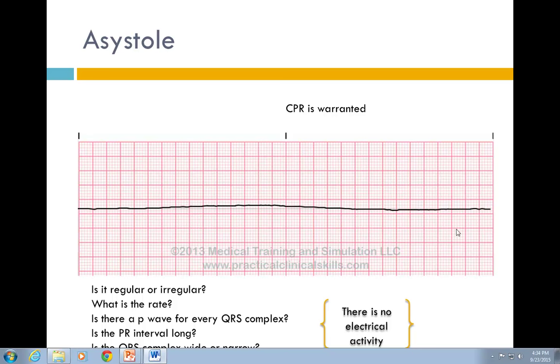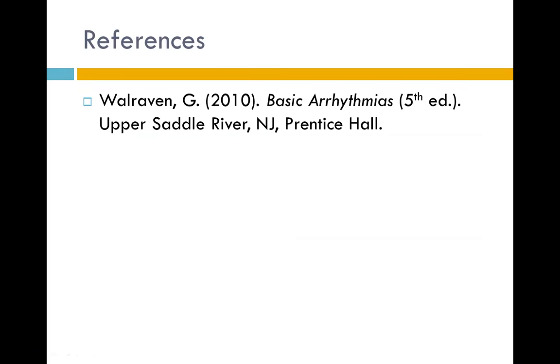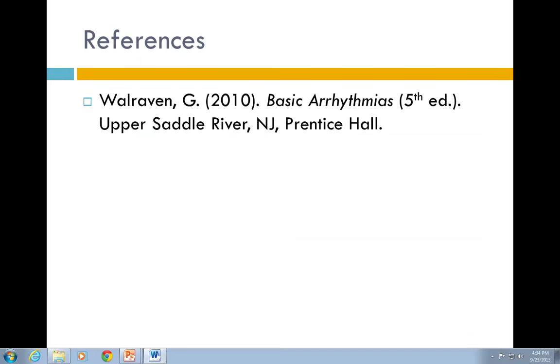I would suggest, though, I've had patients where I saw this on the monitor thinking I needed to bring the crash cart in and begin CPR, and they actually just pulled off one of their leads. So always check your patient first if you're watching a monitor. This concludes our discussion on basic EKG interpretation.